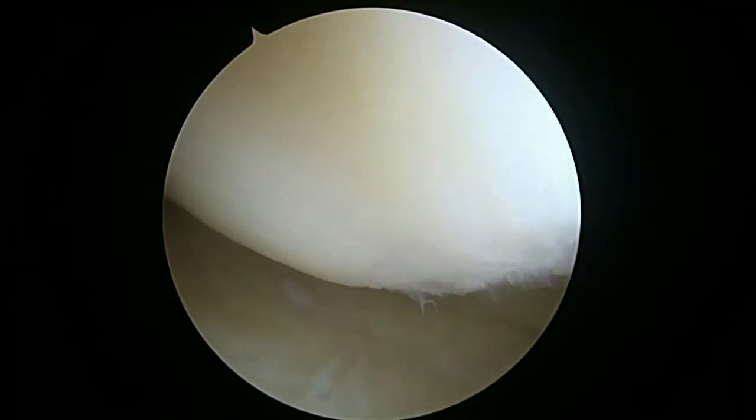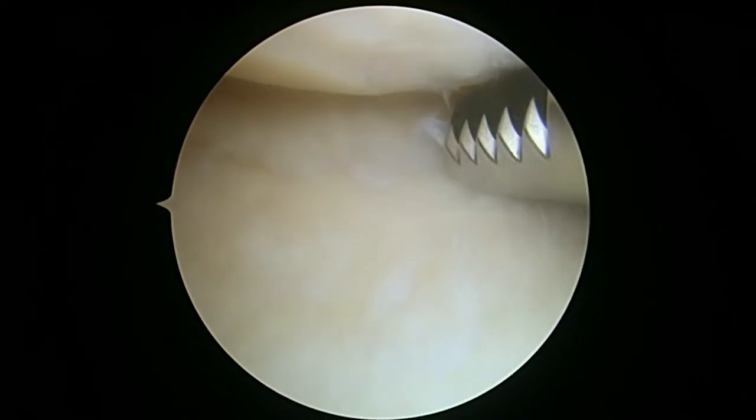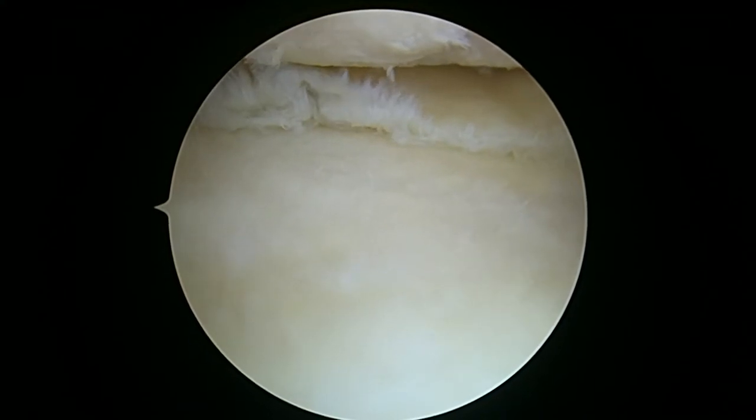Now the meniscus, pull this back just a little bit. As you look here, we can see the meniscus and the tearing in the meniscus here. See this posterior horn. So I'm going to take a pair of scissors here and trim out that posterior horn tear that you see on the screen right there.